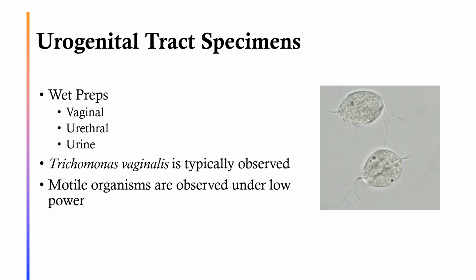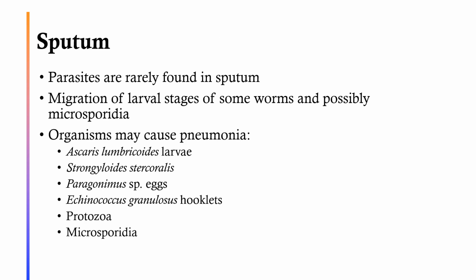Now we can also utilize direct antigen testing. A lot of the times this is going to be a little bit more specific, a little bit more useful than just plain wet preps.